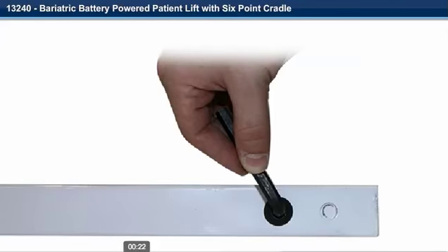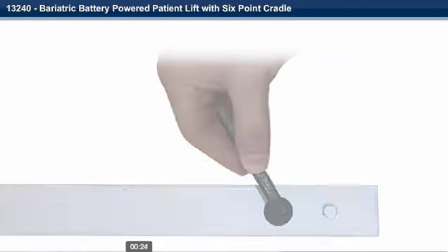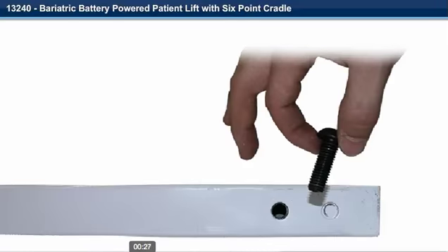Step 3. Remove the Allen head screw cap from the mast of the unit with the provided Allen wrench.